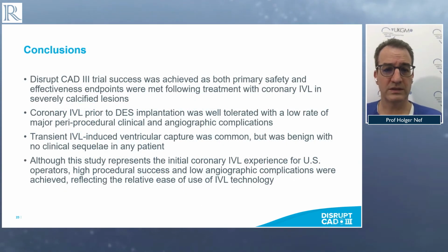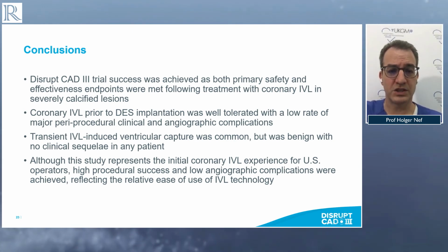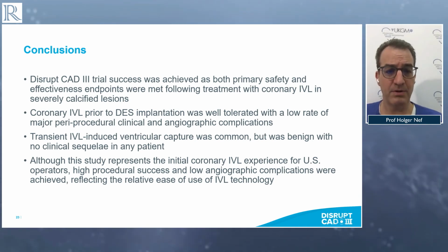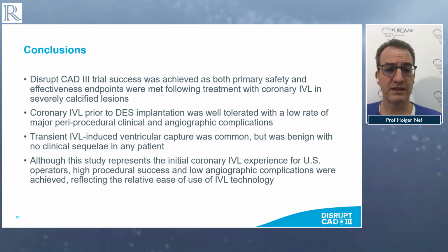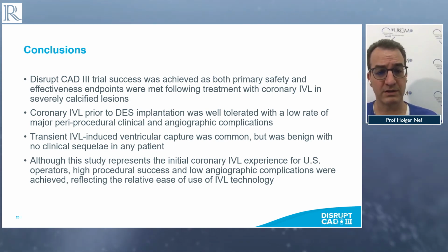So to conclude, Disrupt CAD3 trial success was achieved as both primary safety and effectiveness endpoints were met following treatment with coronary IVL in severely calcified lesions. The IVL prior to stent implantation was well tolerated with a low rate of major peri-procedural clinical and angiographic complications.